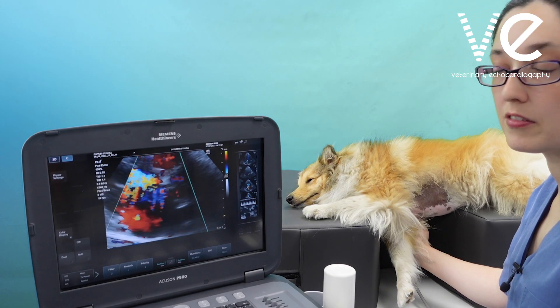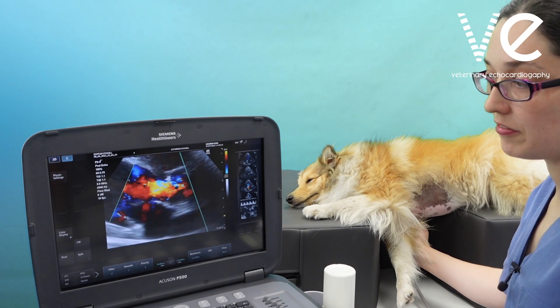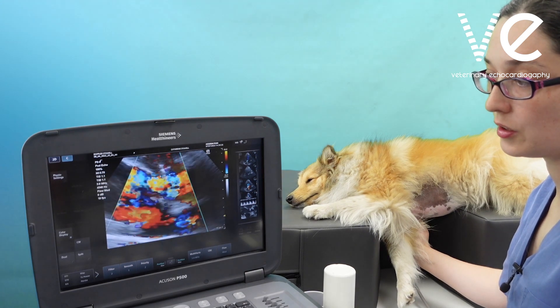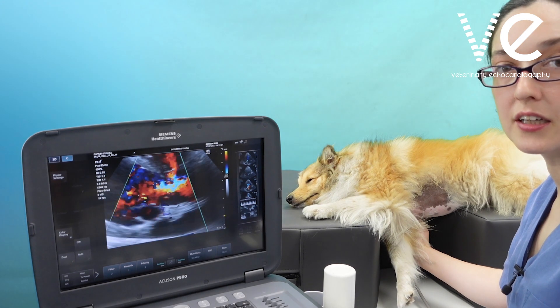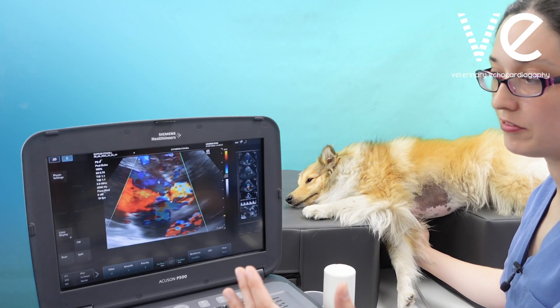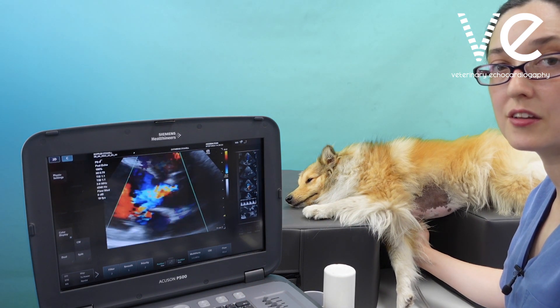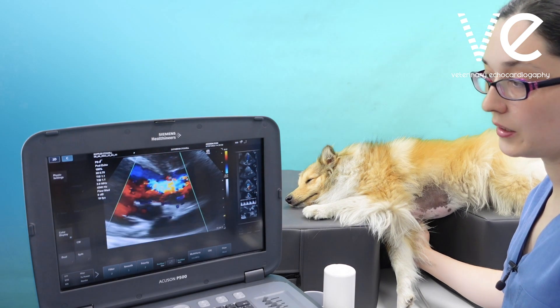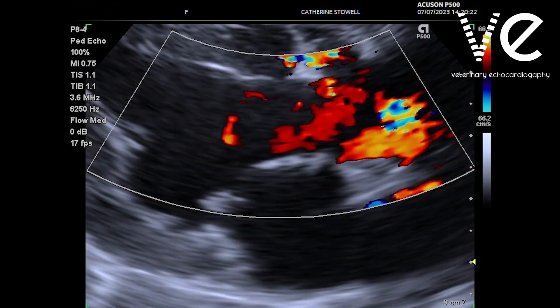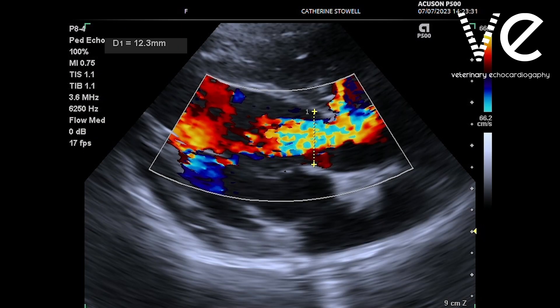Put in colour Doppler over the valve. Look at how much of the left ventricular outflow tract is occupied by the regurgitant jet. Looking at how far the jet goes into the left ventricle is not a particularly good way to assess severity. We can measure the width and compare it to the left ventricular outflow tract diameter to get a measurement of aortic regurgitation severity.